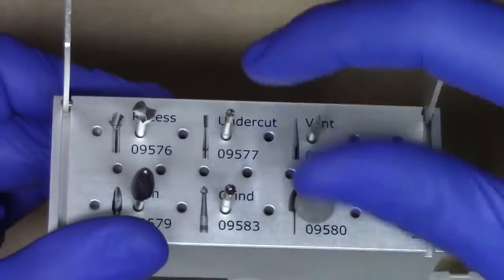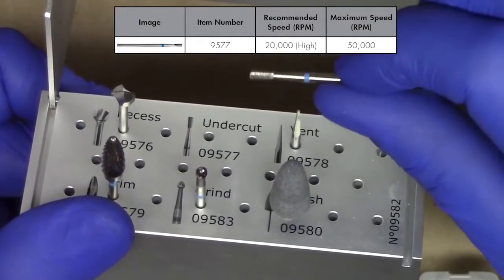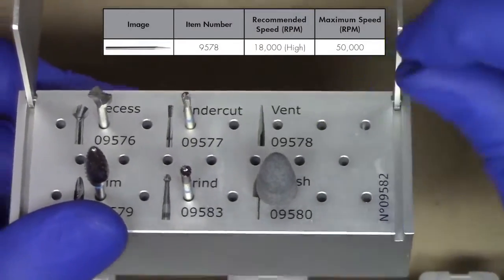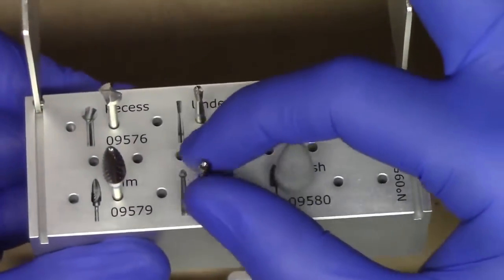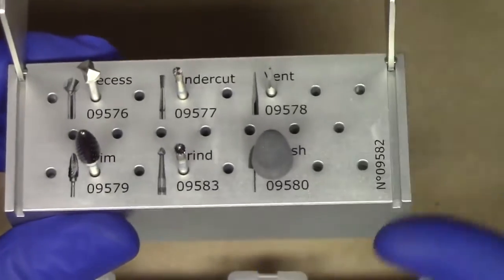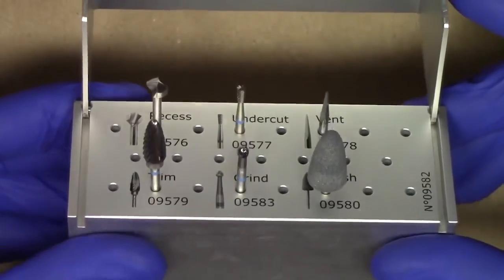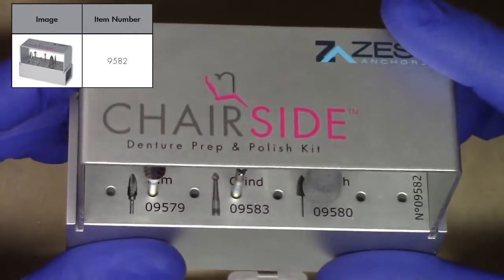Additionally, across the top you'll notice an undercut burr. The undercut burr does just that — you'll create an undercut on the surface of the recess along the walls to aid in mechanical retention of the chairside material. A vent hole burr is utilized to create a vent hole through the lingual slope. The trimming burr is used to trim up any excess material at the end of the procedure. The grinding burr is meant to grind chairside material that might flow out over the sides of the locator denture cap. And the polishing burr, a single-use burr only, is meant to be used at the end of the procedure to fine-tune the adjustments. All of these burrs can be purchased individually, but Zest has provided a unique kit design with everything all in one to facilitate your procedure.